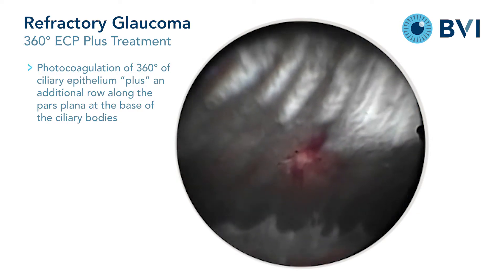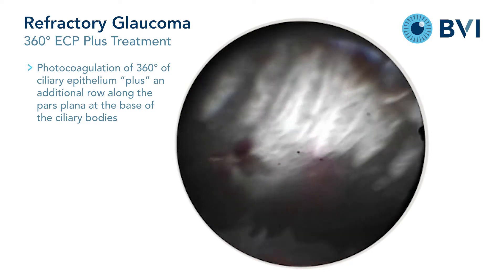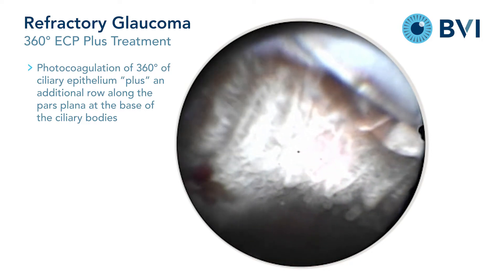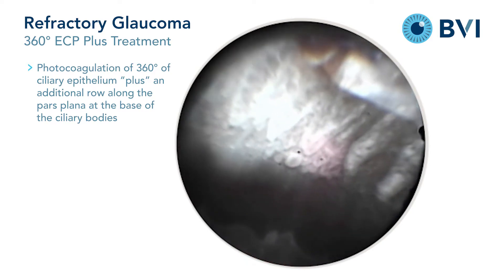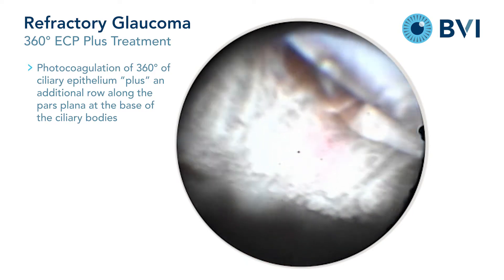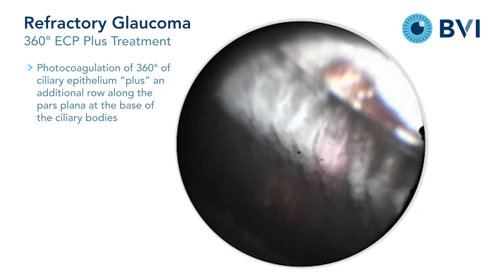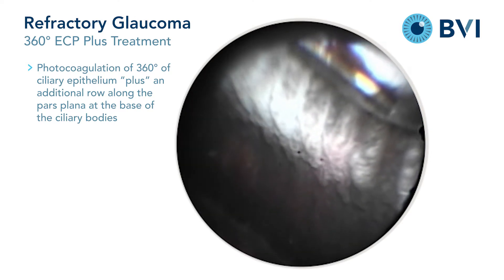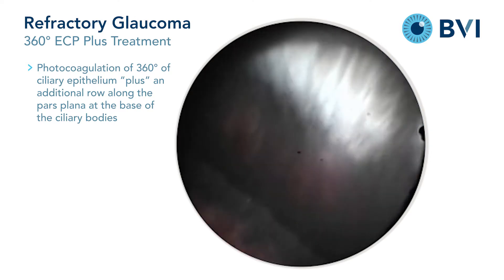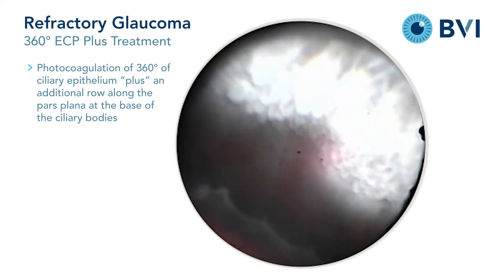In this technique, not only is the ciliary epithelium photocoagulated on the processes, but also one seeks to create a confluent row of photocoagulation lesions on the pars plana at the base of the processes as well. The standard technique is performed with turning the tissue white and observing shrinkage, but tissue explosions are to be avoided.